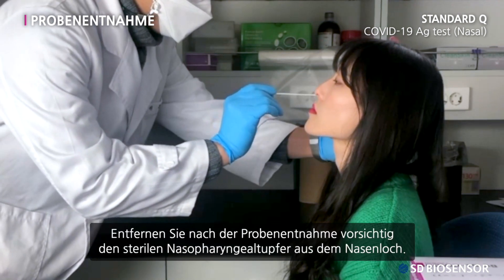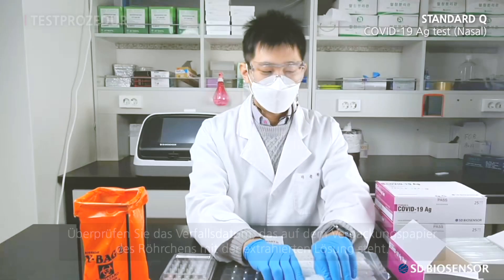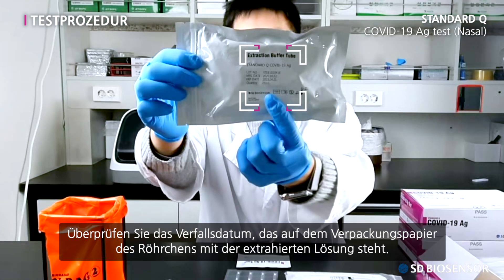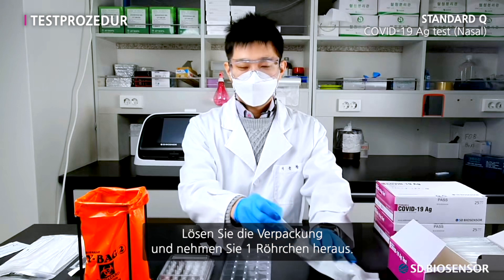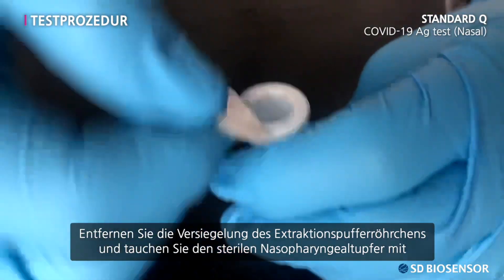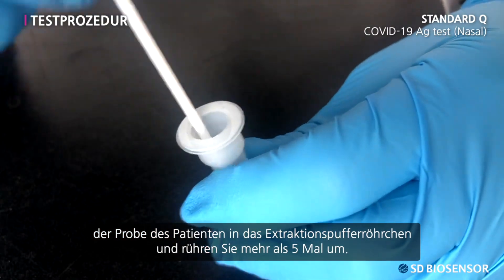After collecting the specimen, carefully remove the sterile swab from the nostril. Confirm the expiration date on the wrapping of the extraction buffer tube, undo the wrapping, and take out one tube. Remove the tube sealing and immerse the sterile swab with the patient's specimen in the extraction buffer tube. Stir more than five times.